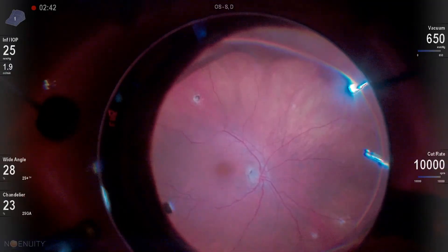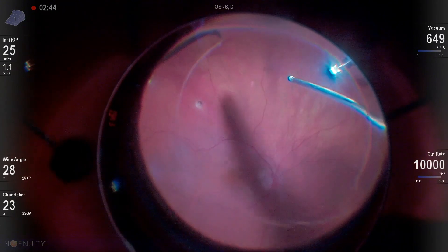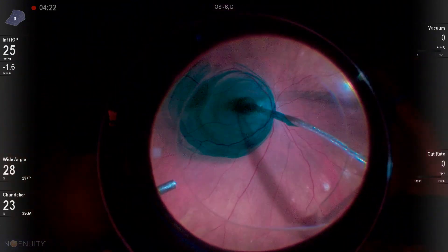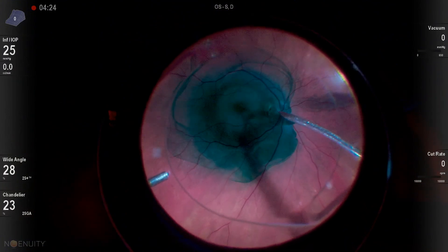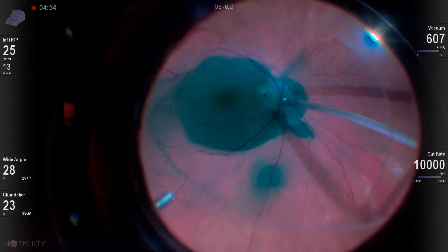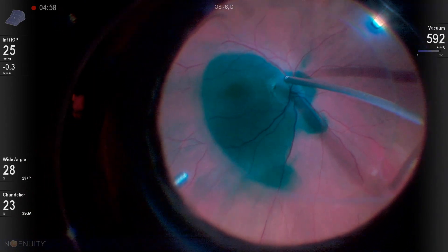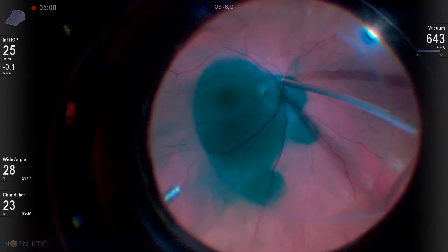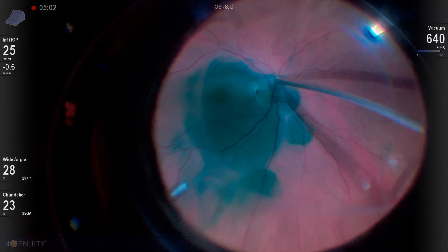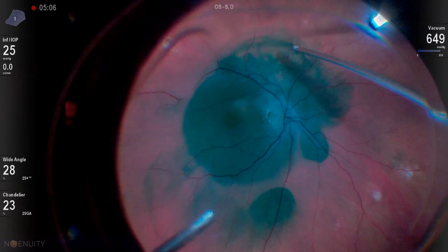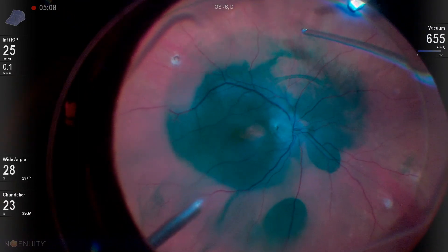Yannick first showed me doing glue for an optic disc pit several years ago at one of the vitreoretinal meetings. So I like to approach these cases like a macular hole case. I'll go ahead and stain with ICG. Here you can see the vitreous is still down, and in many cases the vitreous is still down in these patients. We'll use that ICG to help us identify the vitreous and elevate the posterior hyaloid.